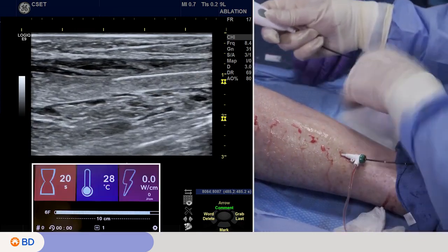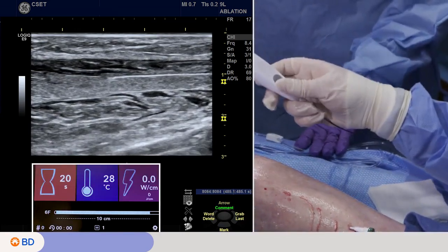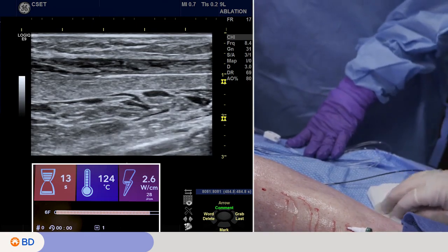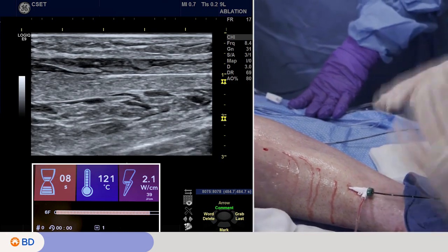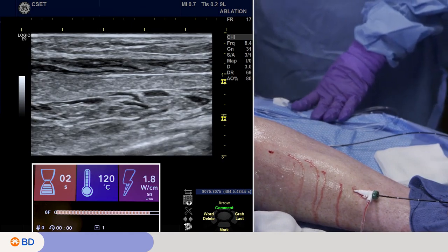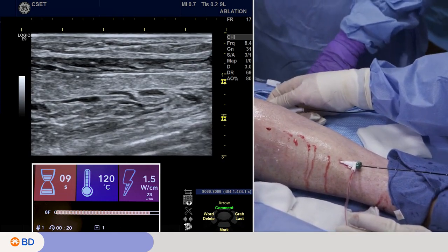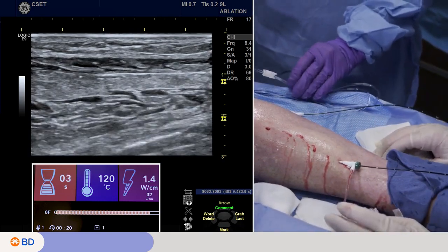And now I'm going to take the handle and activate the Venclose. So I push the button, and we see very quickly the heat is heating up. Within 5 seconds, the target is 120 degrees Celsius. There's an algorithm to maintain that temperature, varying the energy that is being delivered to the coil. And there are 20-second cycles, and so we're going to treat twice at the first location for the small saphenous, and we do the same usually at the great saphenous as well.